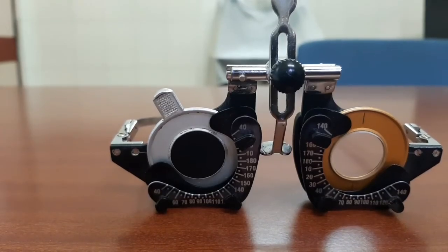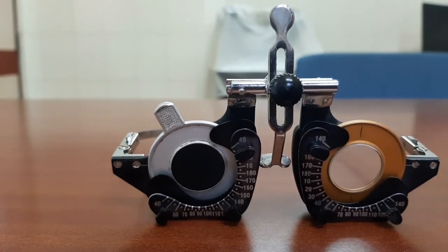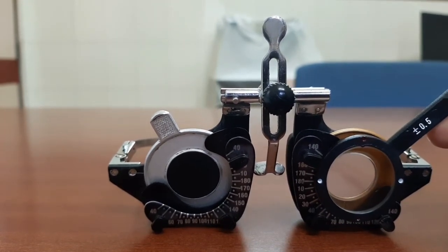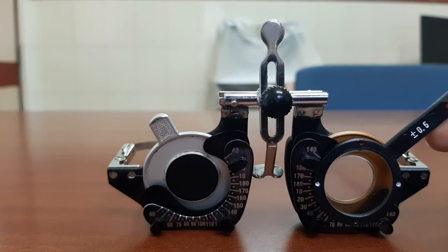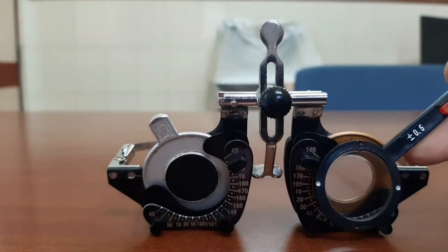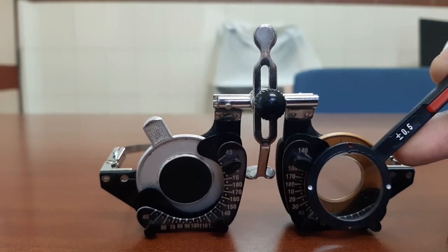To refine the power of the cylinder, suppose the patient has accepted minus 0.75 cylinder at 90 degrees. Place the Jackson's cross cylinder so that its axis coincides with the axis of the trial lens. Ask the patient to read the chart, then flip it and ask which side they prefer. If the patient prefers the side where the red dots coincide with the axis of the cylinder, you will need to add minus 0.5 diopter cylinder to the trial lens.